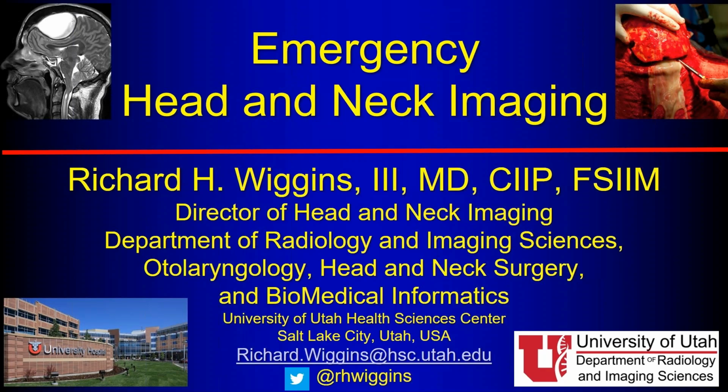We're going to talk first about emergency head and neck imaging, and then we'll talk about central skull base. And these are two good areas to really highlight the differences in the power of the big techniques that we talked about before with cross-sectional imaging and how we use CT and MRI to look at these areas.